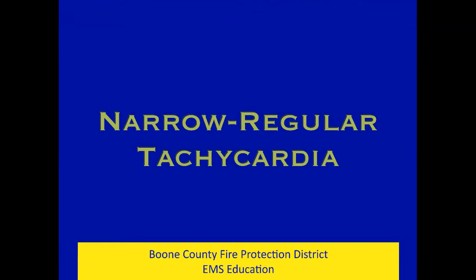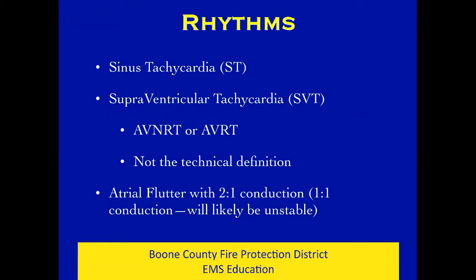Let's learn about and review narrow regular tachycardias. What possible rhythms are there that can be narrow and regular? Well, sinus tach, very common.